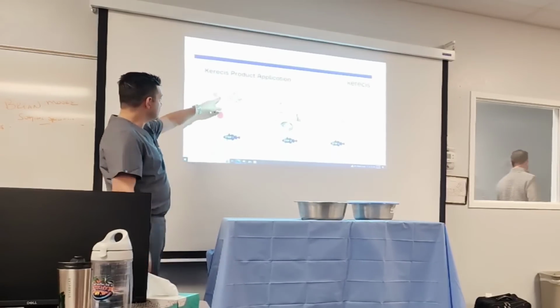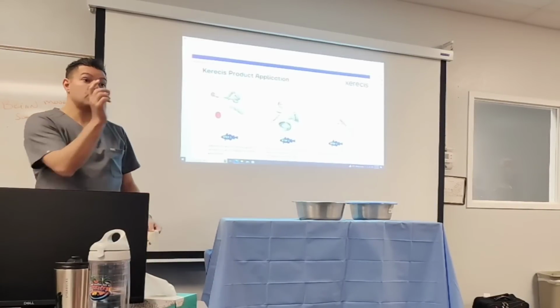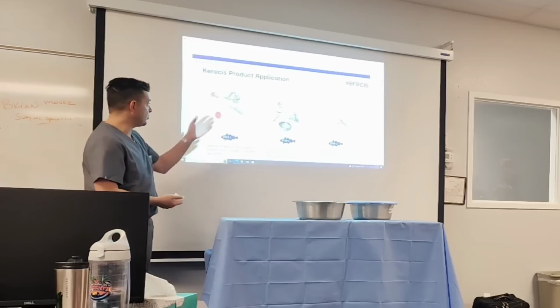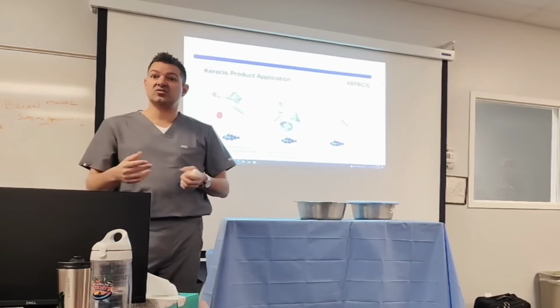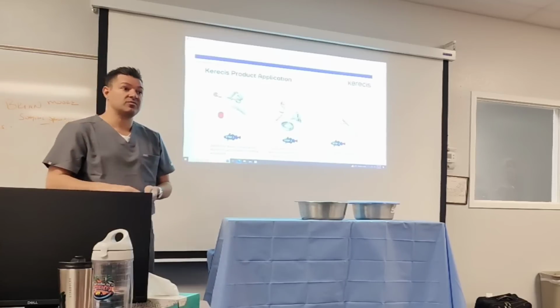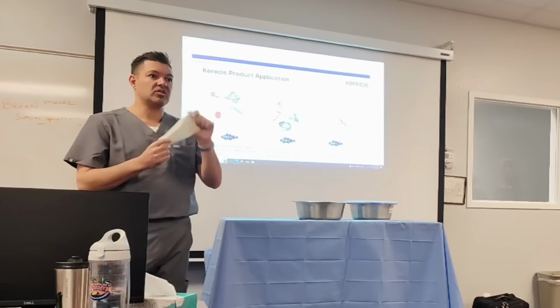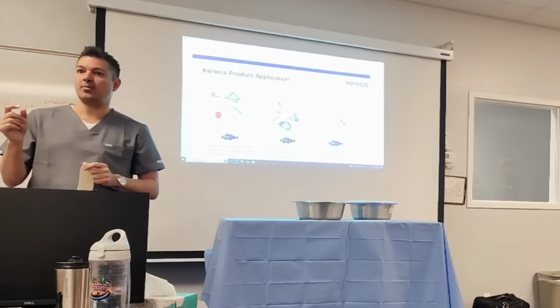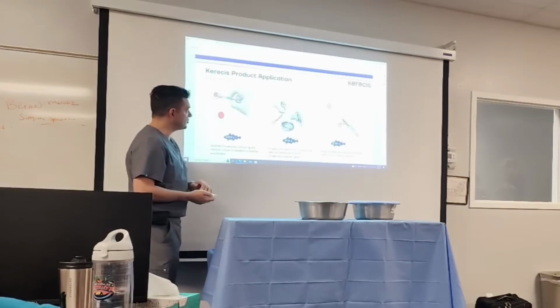So first, we want to do a good debridement, depending on the environment, of course. In a wound setting, yes, it's going to be with debriding, okay? But in an OR case for a dehiscence or something that opens up, you don't need to debride it. There's obviously plenty of blood there, so you can lay it on that particular structure or anatomical area that you want to focus on for regenerating the tissue.